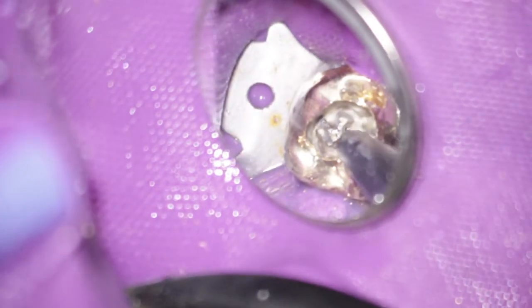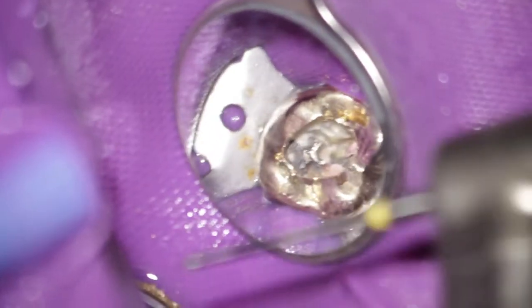So, and now you can see most of the resin has been removed. As you can see, fortunately the post seemed not to have been cemented with resin also, but with Harvard cement instead. This made it easier to destroy the cement gap with an ultrasonic instrument, but we will see this in a second. But there are still remnants of resin in between the wings of the post, and the goal was to loosen the post to finally rotate it out of the canal, but the resin blocked any chance of rotation so far.